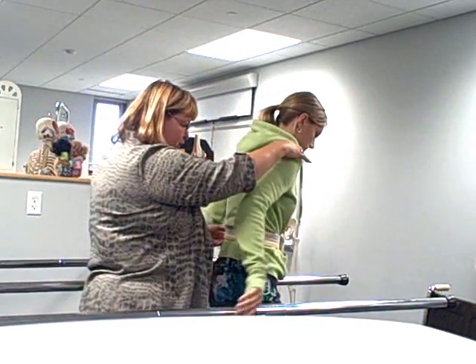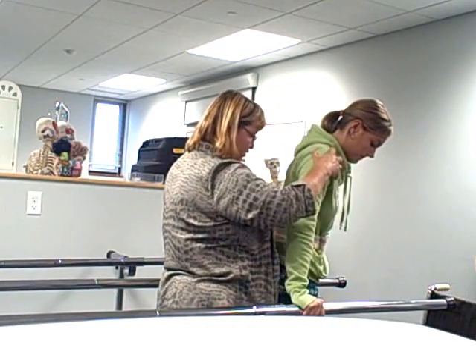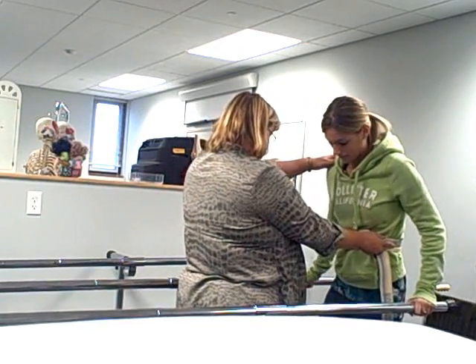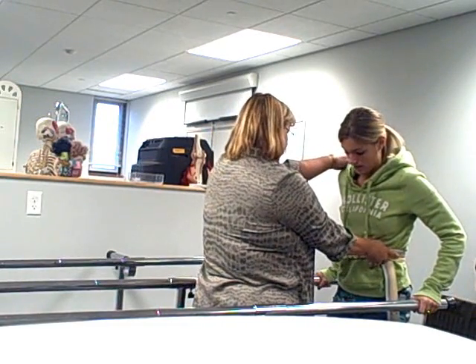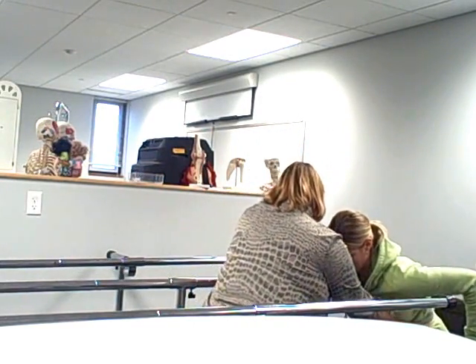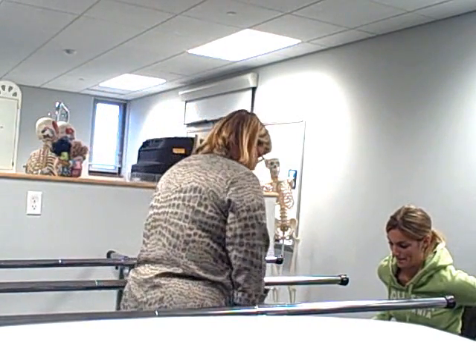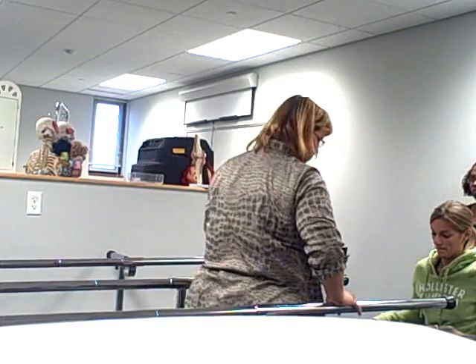Beautiful. Go up a little bit closer to the wheelchair. And then this time you're going to turn again so your strong side is toward the chair. Go back just a little bit more. Now to come down, you're going to bring this foot forward — you can rest the heel — bring your shoulders forward, reach back for the armrests, and take yourself just on the front of the chair. Now if you picture she had a long-legged cast on and I sat her all the way back in the chair, what's going to happen? It's going to kick out. And if I have an elevating leg rest, I can't turn that up because she has a long-legged cast on. Does that make sense? All the words we said before, and now you've seen them.